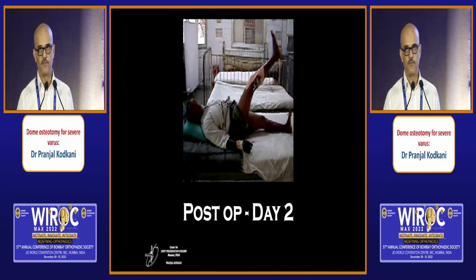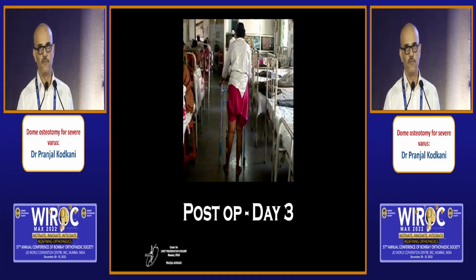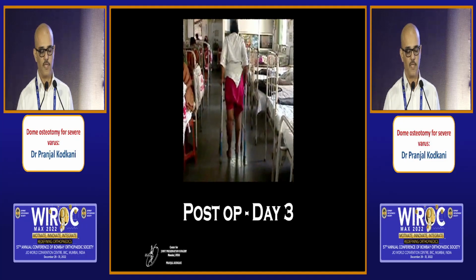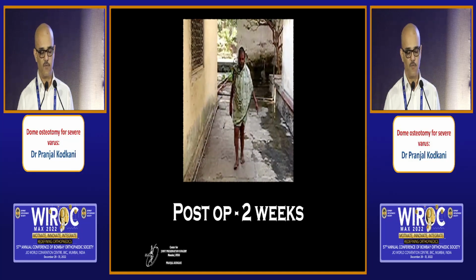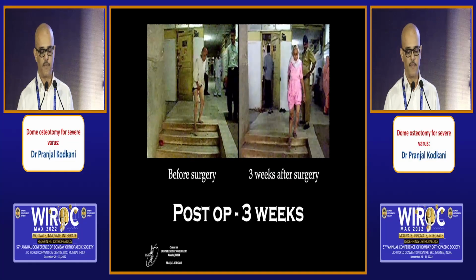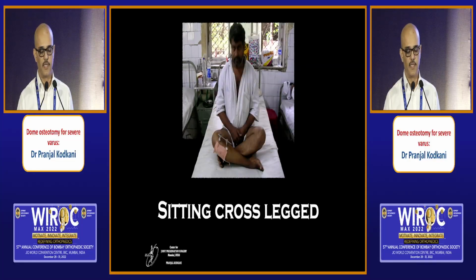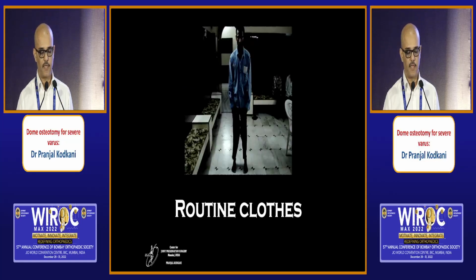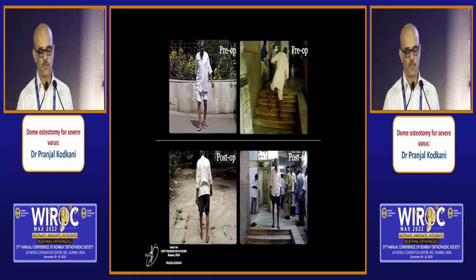So we start with full range of motion by around day 2 or day 3, and we ask the patient to full weight bear as early as possible. They are mobilized from the 3rd day, and by 2 weeks, they usually would leave their walker and walk full weight bearing. By 3 weeks, they are climbing and descending stairs quite comfortably. They can sit comfortably cross-legged because the fixator is quite compact. Even wearing regular clothes is not difficult because, again, the fixator is compact.